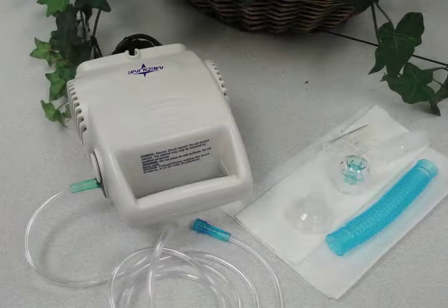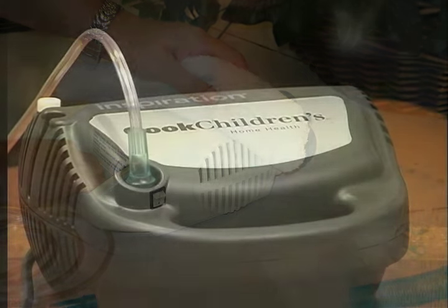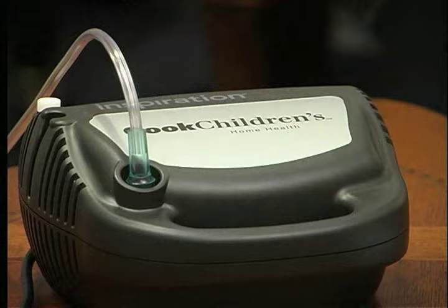You will not need to wash the air tubing or the compressor. If the compressor does get dirty, you may wipe it with a damp cloth. Remember, there are many different brands of compressors. You will need to follow the manufacturer's instructions for the specific care of your compressor.